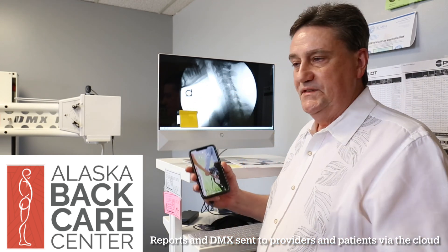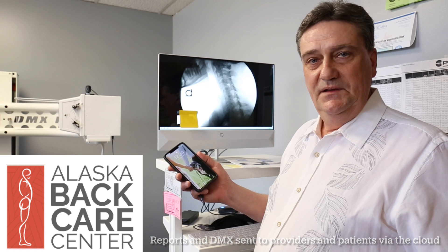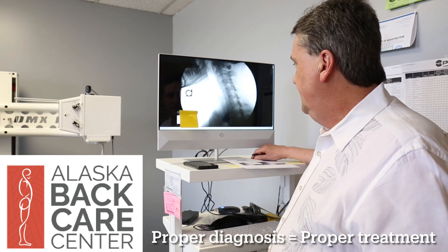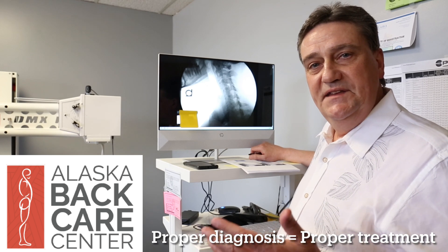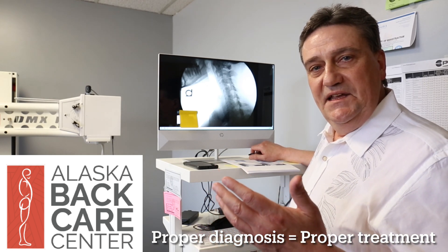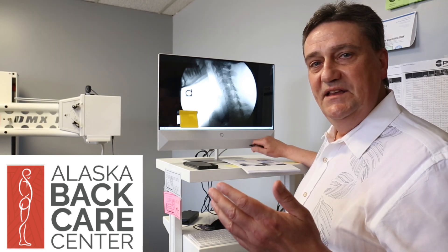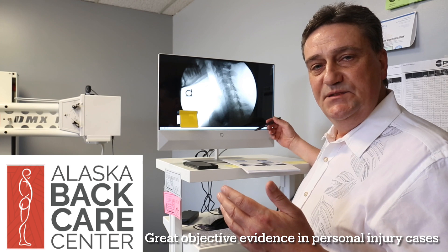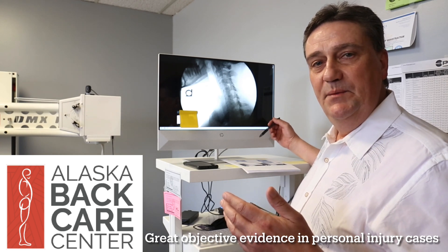We can even put all this information on your phone with this new system we have. It's great for her because she found the reason for her chronic pain, great for her doctors because they now have an accurate diagnosis they can direct treatment to, and it's also great for her attorney who now has objective evidence of this permanent impairment from her whiplash injury — something the MRI did not pick up.